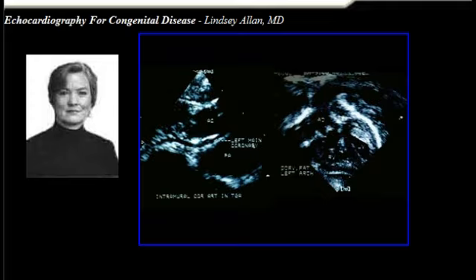But you must remember what's important to the surgeon, and in this particular newborn, all that was important was the side of the arch, so that the surgeon could decide which side of the chest he's going to open. This, of course, is very crucial, so they had to go back up and look for that specifically. And here you can see it looking from down below. Here's the aortic arch sweeping over to the left, and therefore the surgeon knows to go in on the right to place the shunt.